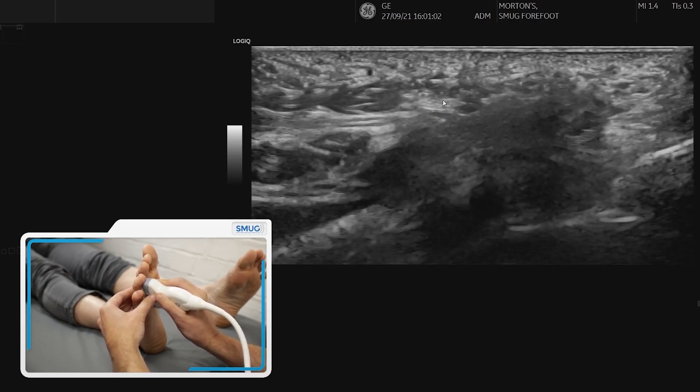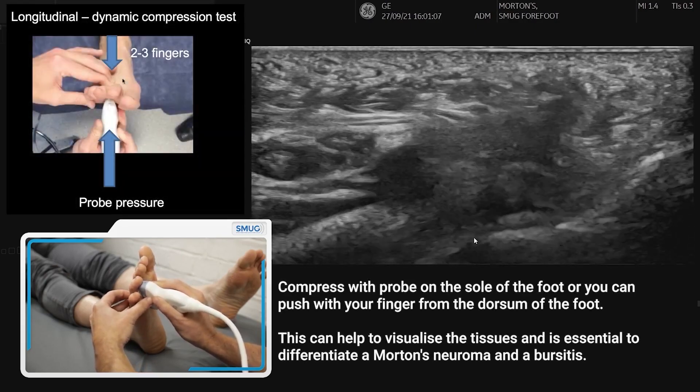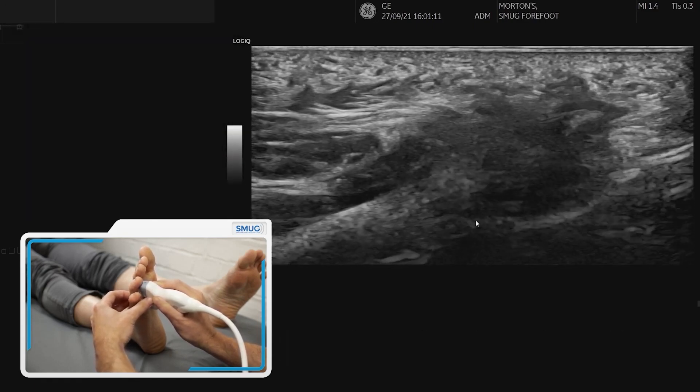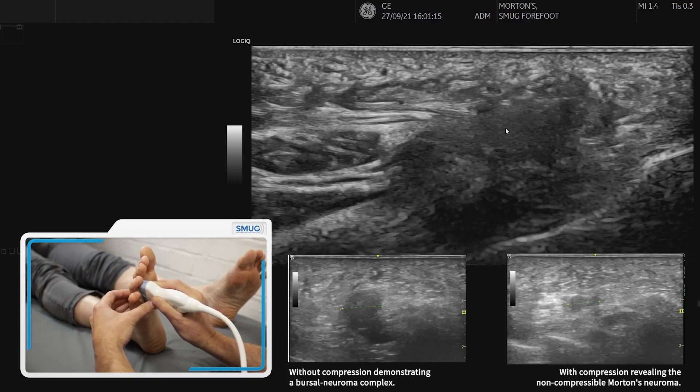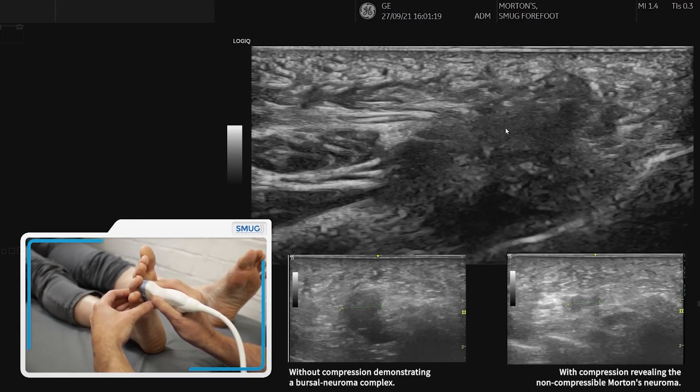We can compress with the probe, or what I find quite useful is to compress with my finger. That will give us information on whether the lesion we're looking at is compressible or non-compressible, and that will tell us whether there's a neuroma, a bursa, or most commonly a bursal neuroma complex.